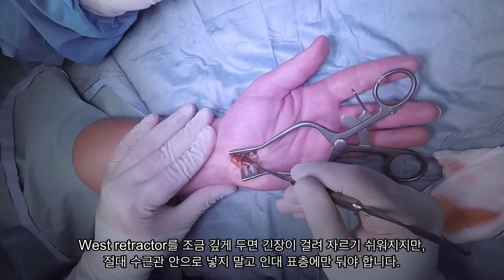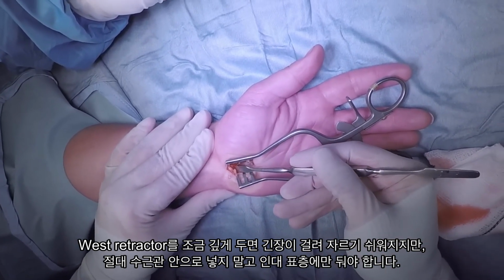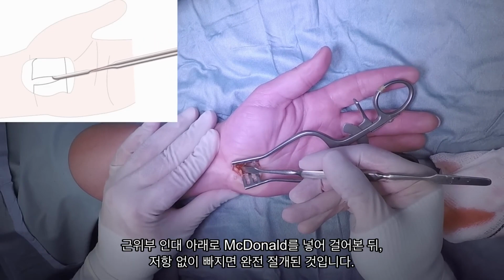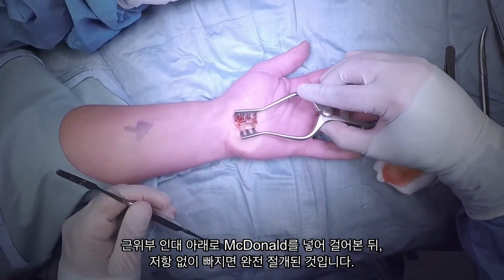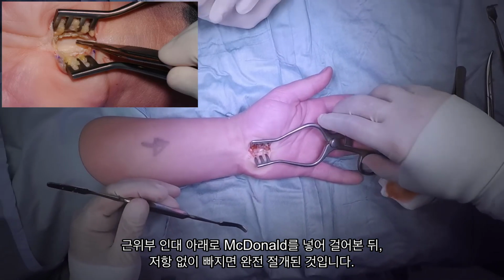To check your release, insert the curved end of your McDonald under the ligament proximally and lift up, effectively trying to hook the tip around the proximal border of the ligament. Try to pull it back out gently. If the ligament is divided completely, it'll slide out without any resistance, but if not, you'll feel the lip of the remaining ligament, so use your scissors or blade as before to divide it completely, before checking again, and then checking your distal release. Once that's done, inspect the nerve, and then you can go ahead and start closing.